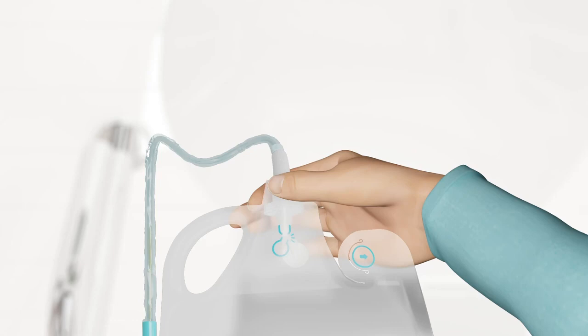Also, move a little and straighten yourself up. If urine starts flowing again, wait until it stops. Repeat the stepwise withdrawal until you feel sure that you've drained any remaining urine. Remaining urine is rich in nutrients and is the ideal medium for growth of bacteria. If you find it difficult to see if urine is still draining, use your fingers to feel if warm urine is still draining from the end of the catheter.